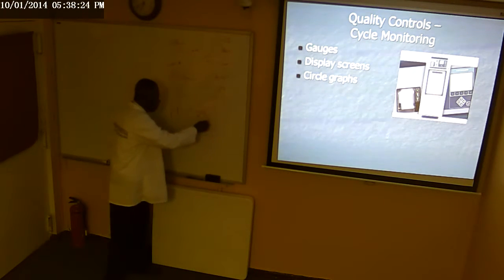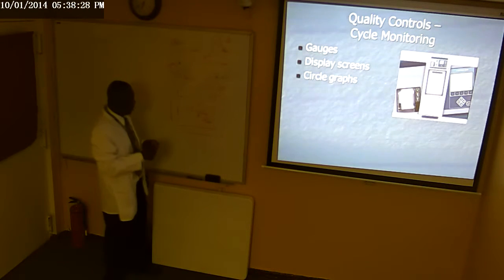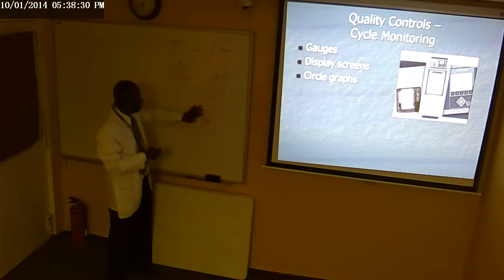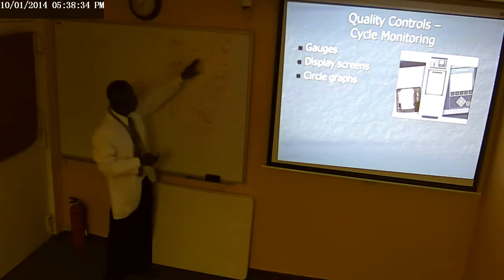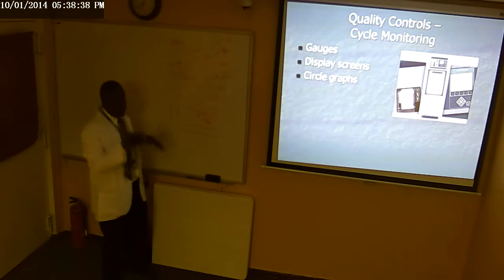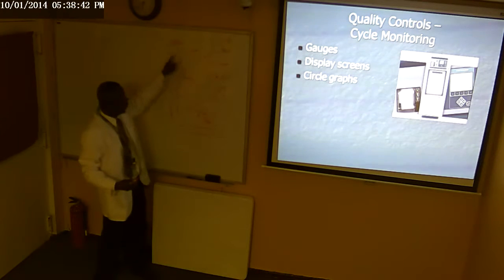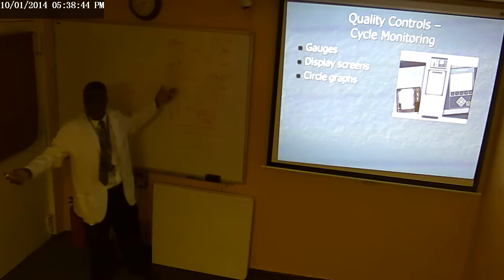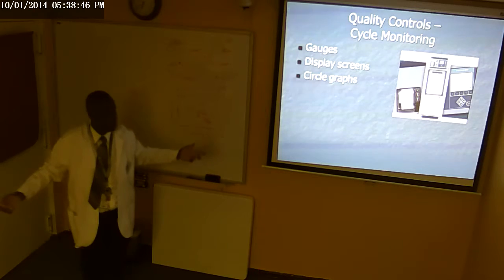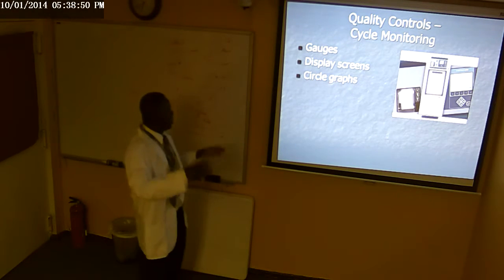So at the time of sterilization, the pressure inside the jacket and the pressure inside the chamber is the same, which means both pins will be pointing at what? 31 pounds. When the process is complete and steam is moved out of the chamber, the gauge will move back to where? Because there's no what? Steam. So those are the gauges. The gauges measure the pressure of steam.